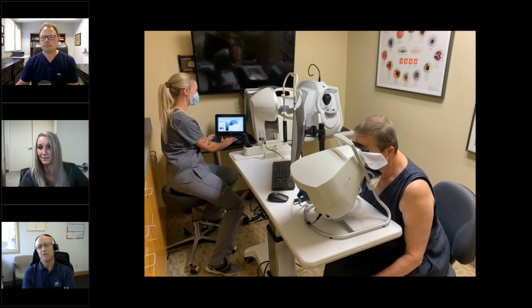Can you comment on the fixation control in the Smartfield? I know there's two types of control. There's the blind spot monitoring where, every once in a while during the test, it goes back and checks the blind spot. But there's also central fixation where it's checking centrally. Is there a preferred control method in your practice that you use with the Smartfield?